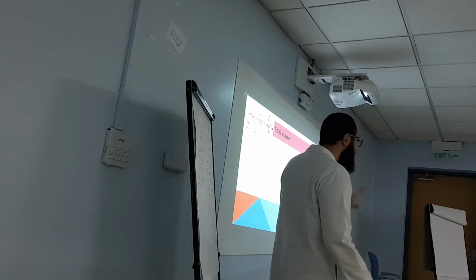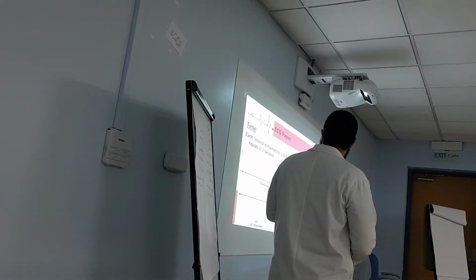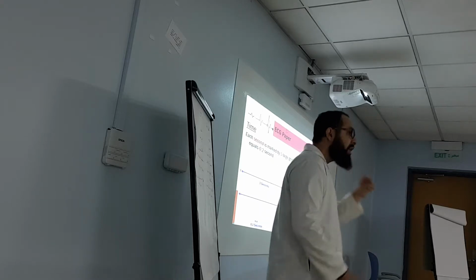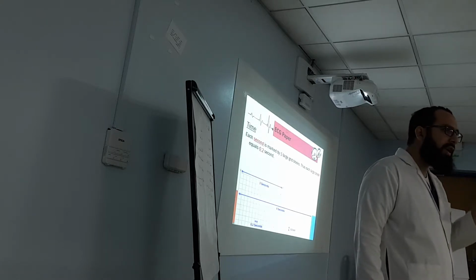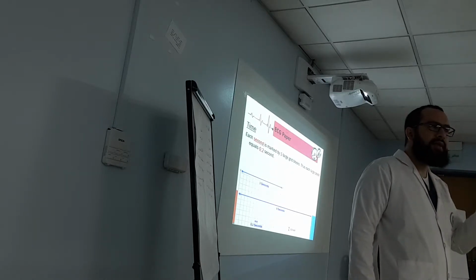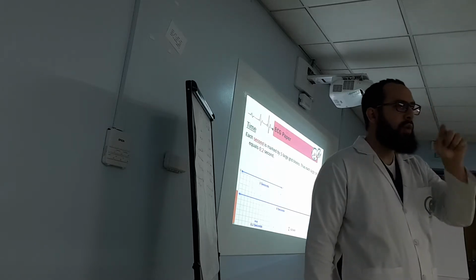Just remember this, as this is basic knowledge before we move forward. And this is the standard speed. For time, each second takes 5 large squares, and each large square equals 0.2 seconds. So in 1 second I have 25 millimeter, or 5 large squares. How many seconds are in 1 large square? I have 1 second for 5 large squares. I want to see how much time is in 1 large square only.